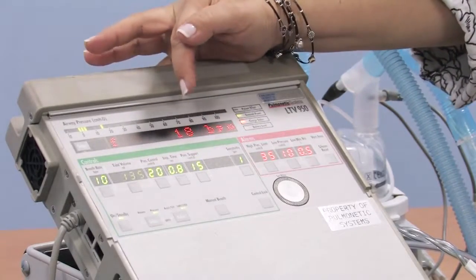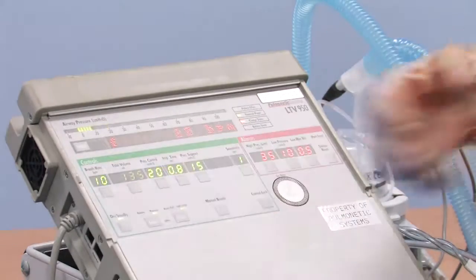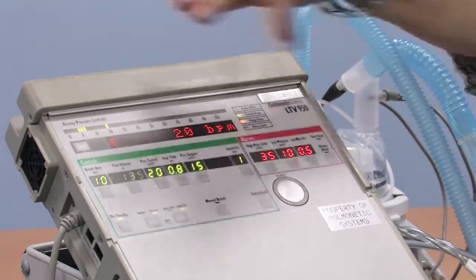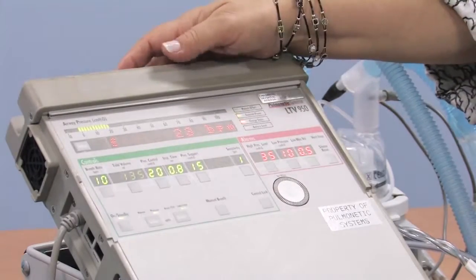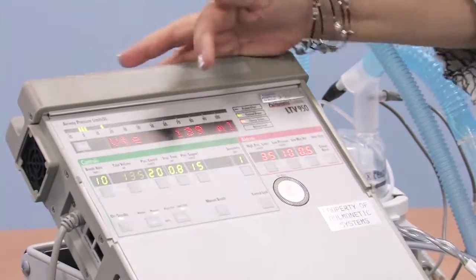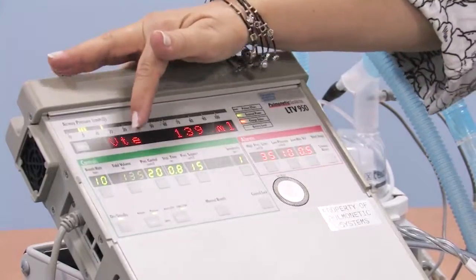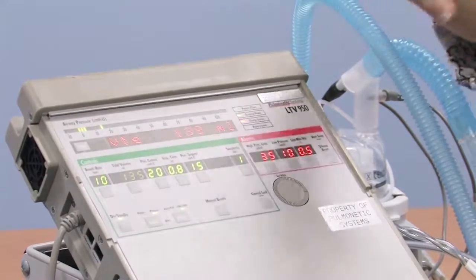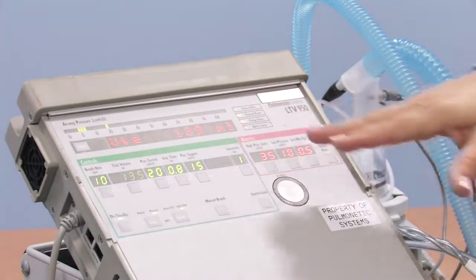So right now it's telling us that our patient, our child's total breathing rate, 10, the machine's firing no matter what, but there's a total of 20 breaths a minute being taken and received by the child. Then the machine looks at something called VTE, which is exhaled tidal volume. It goes backwards, exhaled tidal volume. So this is the size of the breath that your child is receiving, and it's in milliliters or cc's.